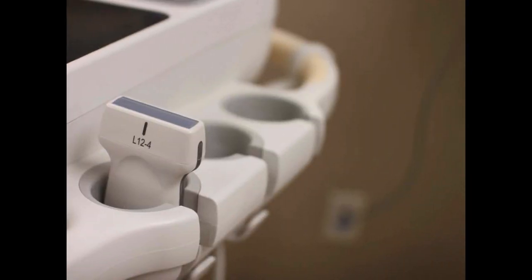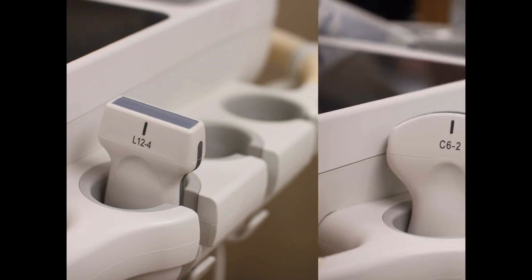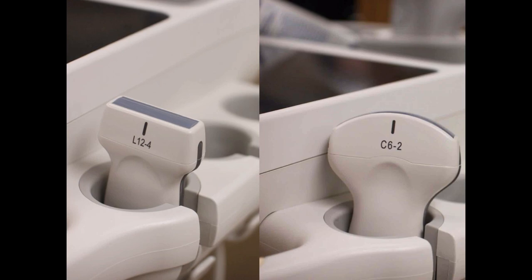Your probe of choice for this exam is going to be the linear probe. It's a high resolution probe that will give you good images of the superficial structure of the soft tissue. You can also use the curvilinear probe, but the resolution isn't going to be quite as good.